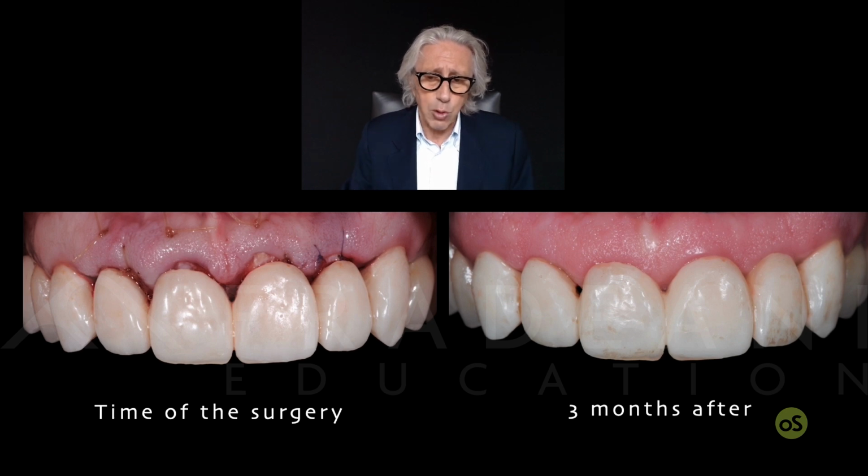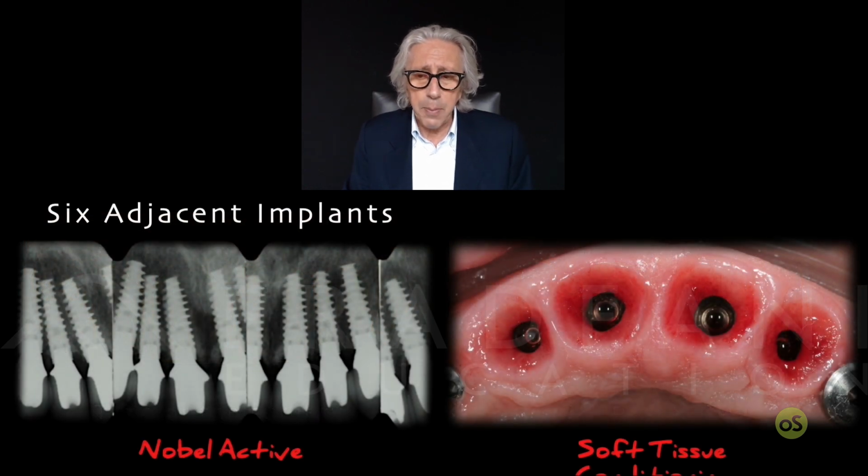So we have the provisional loaded on 4 implants with the 2 cantilevers on the 2 cuspids. Even though it's not the ideal case of having cantilevers, of course we can remove all the contact on the cuspid guidance. We believe at this point that we have a group function that will be better in this situation. So, at a certain point, before having the final osseointegration of the cuspids, or at least the final conditioning of the soft tissue of the cuspids, we had the chance to condition the 4 anterior incisor areas with our provisional in the best way.